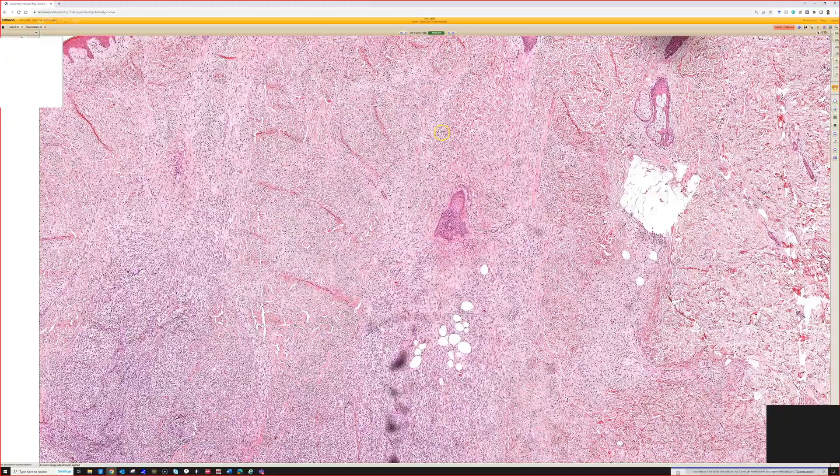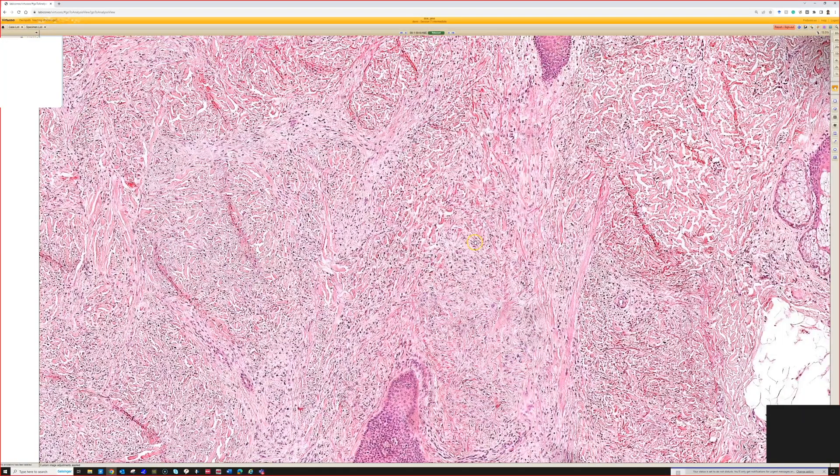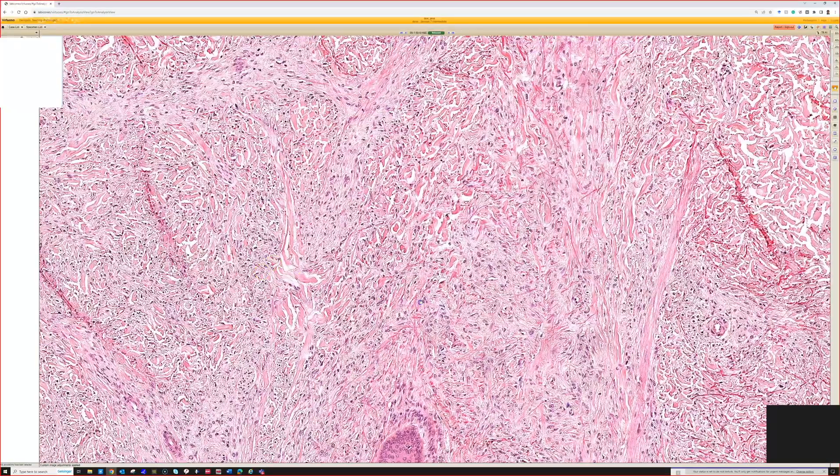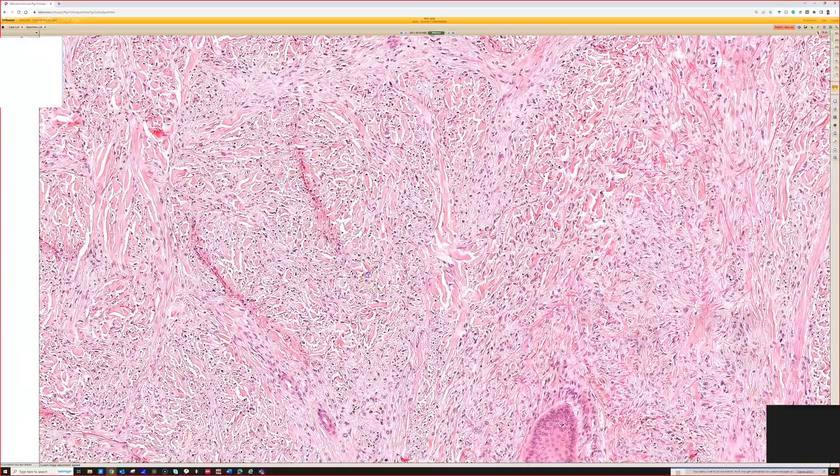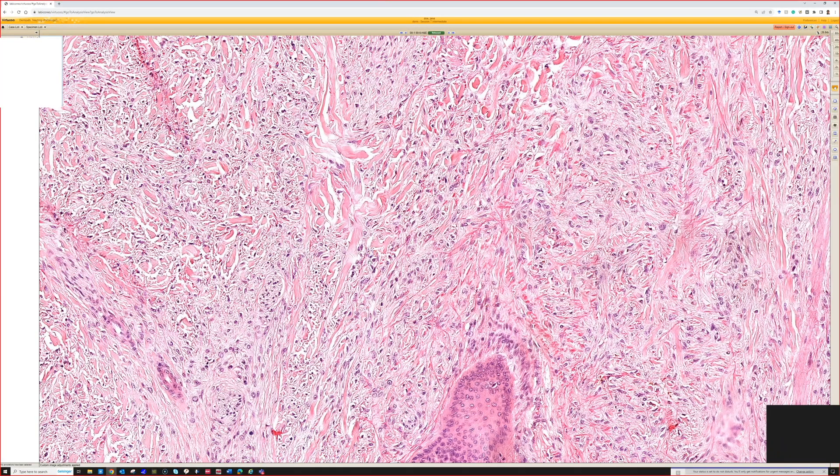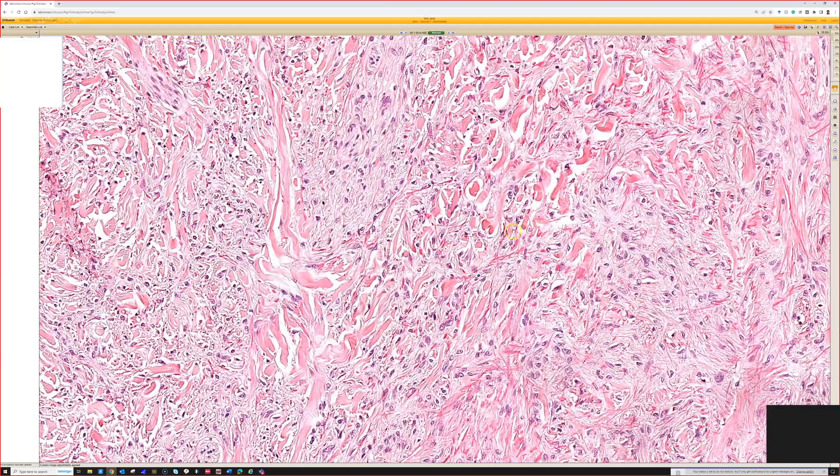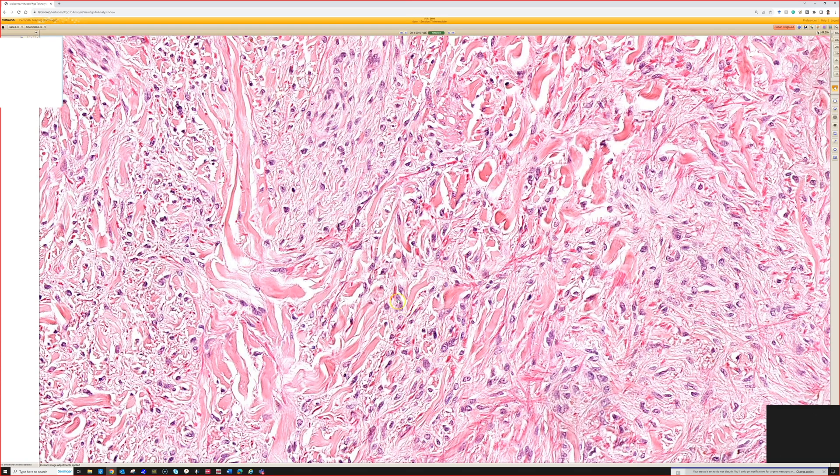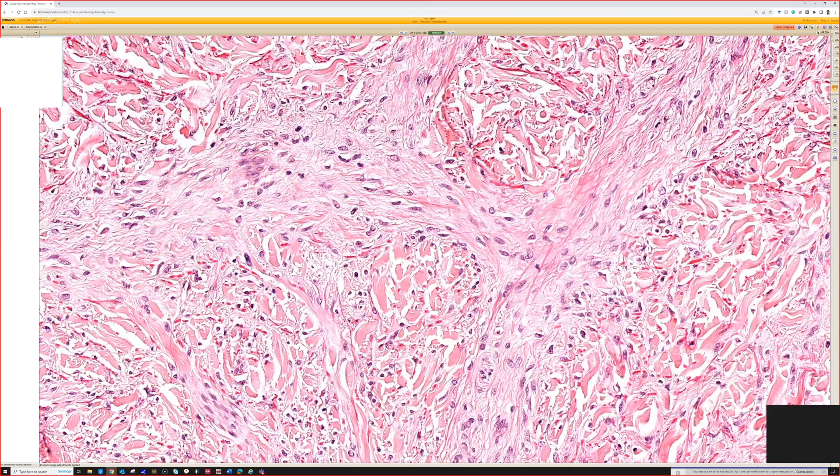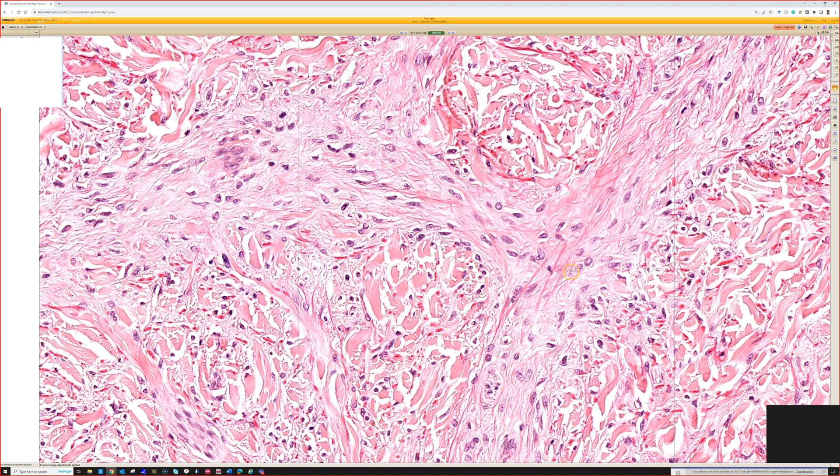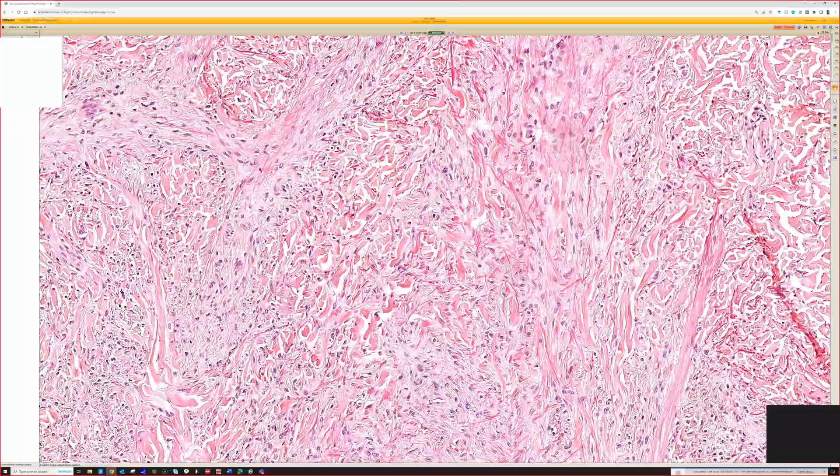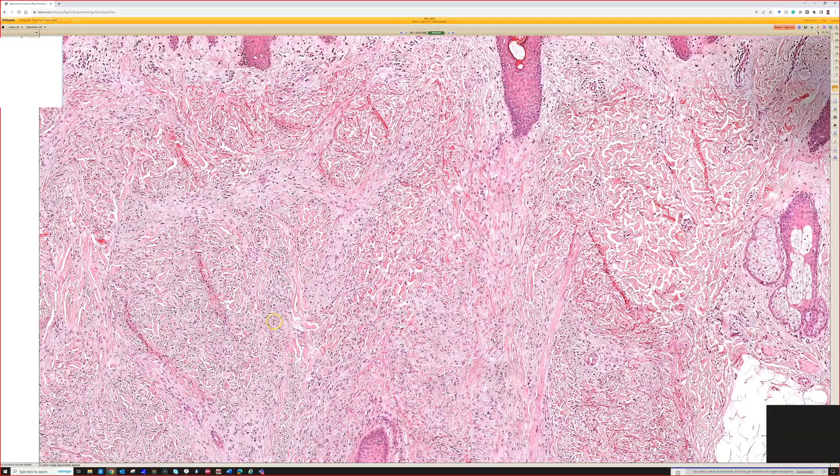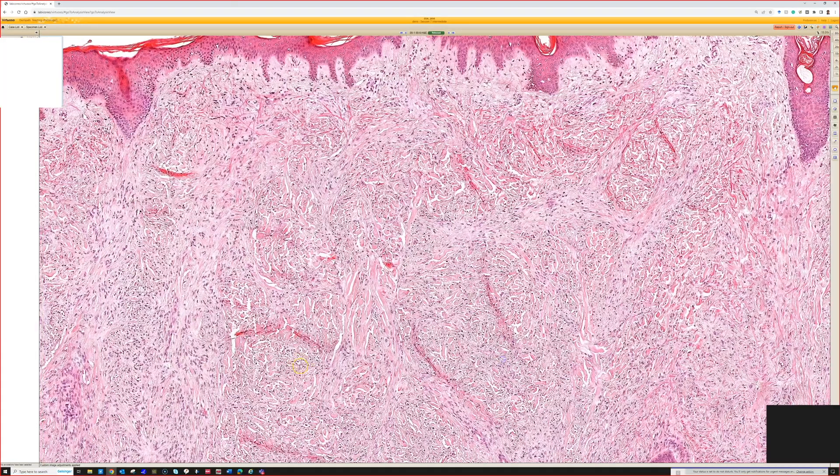And out to the periphery, you'll see areas with much less cellularity trickling between the collagen—collagen trapping—sometimes with variable amount of pigment resembling regular blue nevus. Oftentimes the pigment in these is not as abundant as in a conventional blue nevus. If you look around you will find little bits of melanin pigment here and there, but the cells and cellularity and growth pattern at the periphery look more like a regular blue nevus.